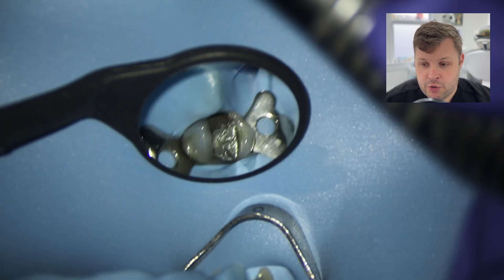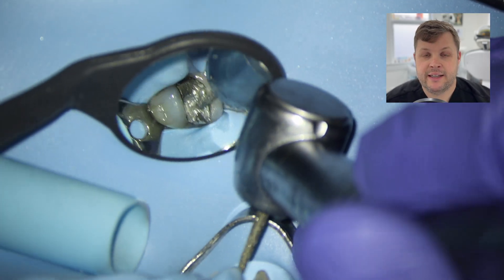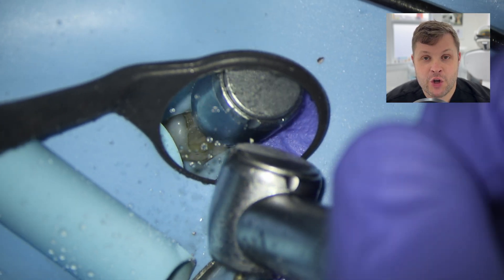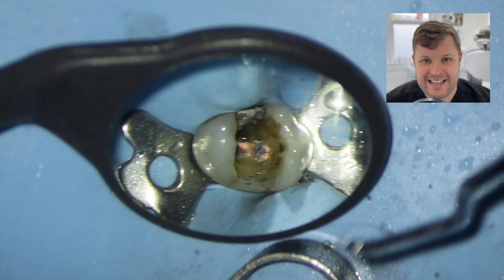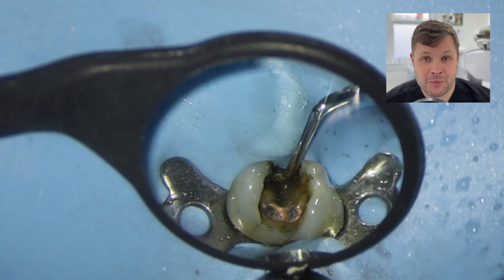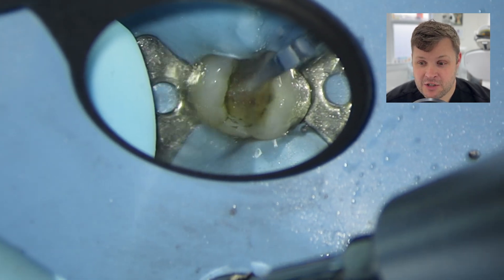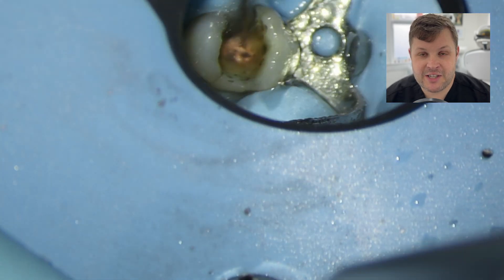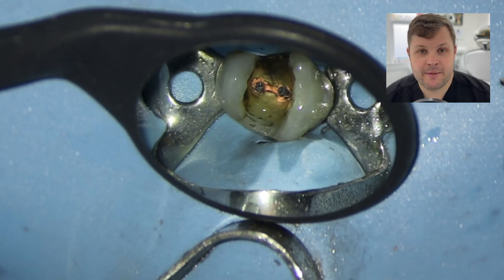The first thing we're going to do is remove the old amalgam filling. Early in my career I used to make a small access cavity right down the middle of the tooth, but the problem is the amalgam gives an erroneous apex locator reading. Once we remove it, I can immediately see that we've got some thermophil carriers here.